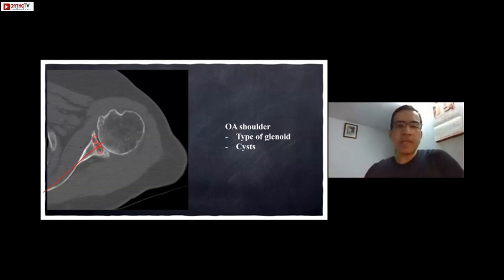If I have made a perfect diagnosis, I know that it's a cuff tear of short duration, and I'm not suspecting a great atrophy or infiltration, I may proceed with my surgery. But if I feel that no, this is an old cuff tear, there may be something else to it, or let's say it's a SLAP tear.